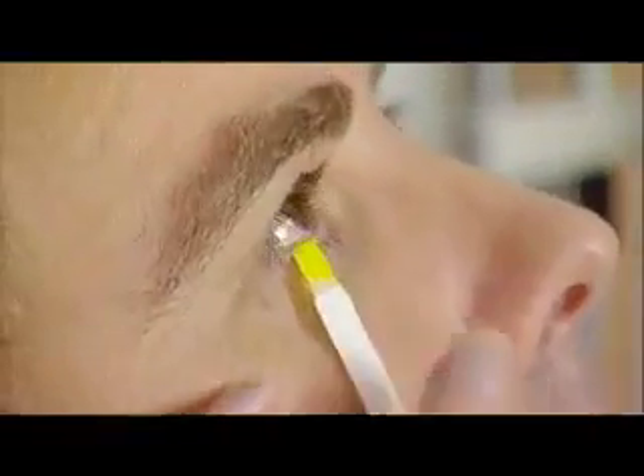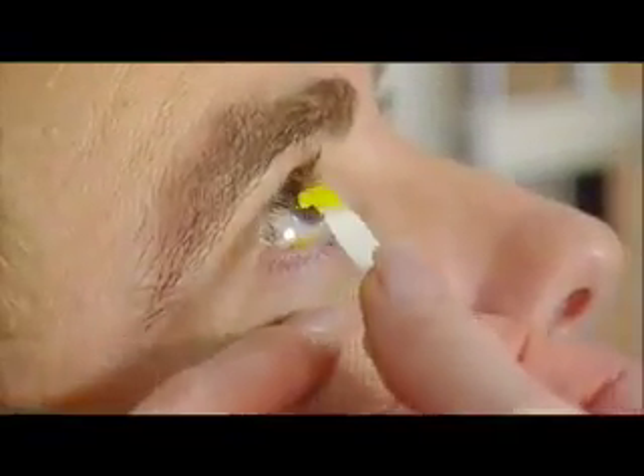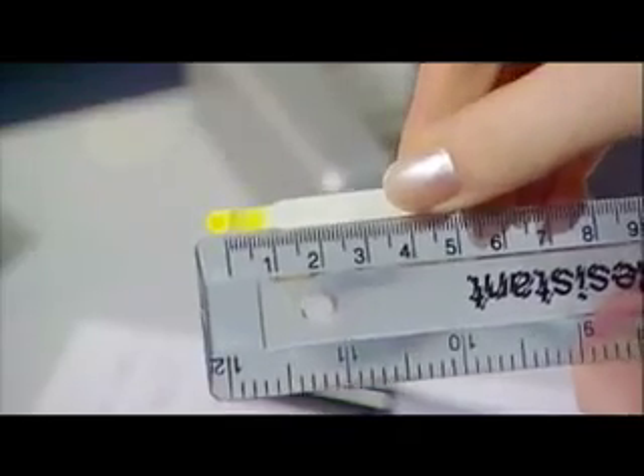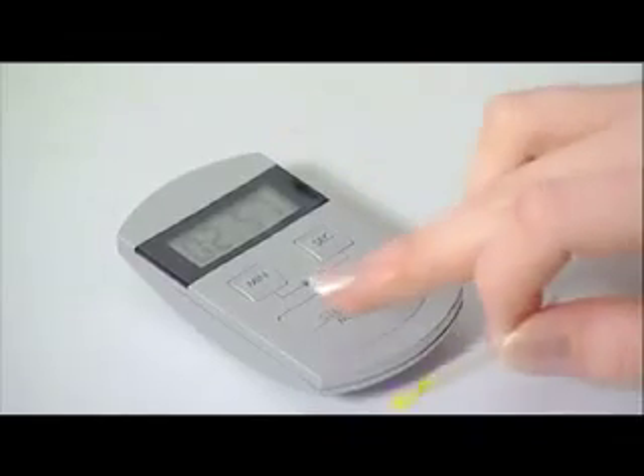On removal, the distance from the strip notch to the wetted dye front is recorded. The strip is then air-dried.